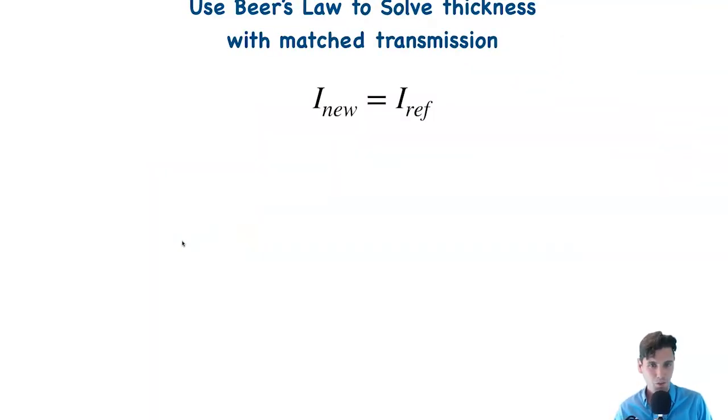Real quick, we'll just go through the equations quickly. Don't get scared by the equations or feel like you have to memorize them, but we just want to define first what the equations are that the little calculator is using, and then we'll just play around. The more important thing I feel is that we get a sense of how the different materials compare to one another, and how those properties change as a function of energy, for instance, of the X-ray beam.